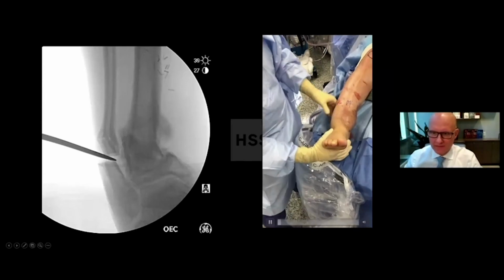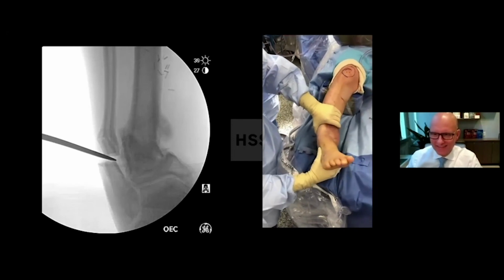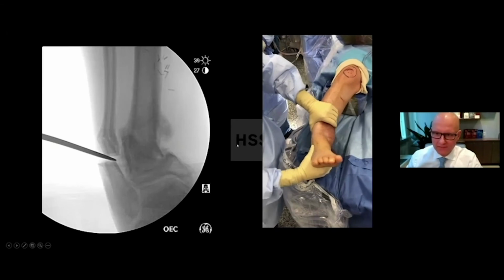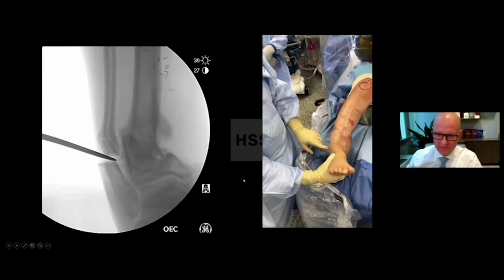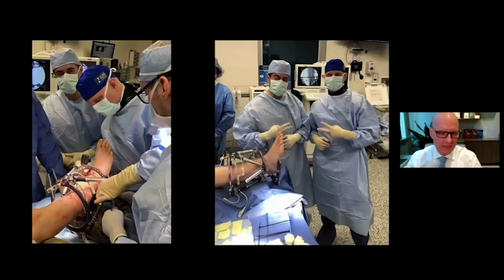This is a video. Oh, it actually works. Amazing. We're looking at the stability of the non-union. And you can see how that is pretty stable. His non-union's not moving much. Less than 5. That's after fibular osteotomy with no hardware. So I graded that as a stiff non-union, so we could pull through it. There's the intraoperative mobility of the non-union. So I thought this was a good case for that.